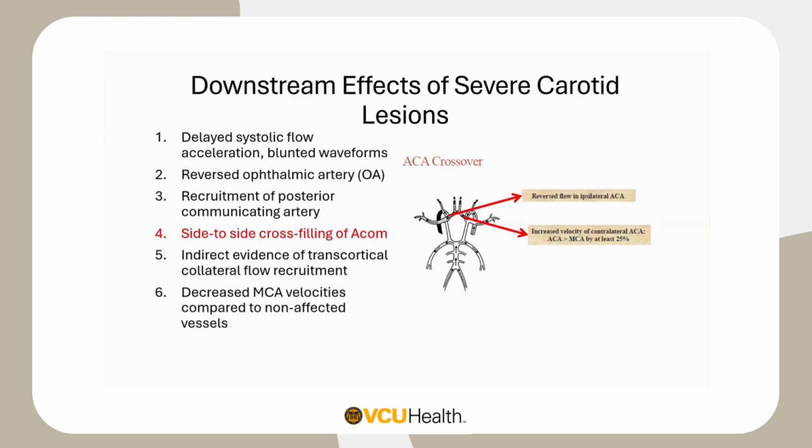This is where I know there was a question in the previous talk about using transcranial duplex versus M-mode blind TCD. This is definitely where duplex imaging is going to be to your advantage, because you want to pick the right vessels to look for that reversal of ipsilateral ACA, or when comparing ACA and MCA velocities and potentially reverse velocities, that you're capturing the right vessel.